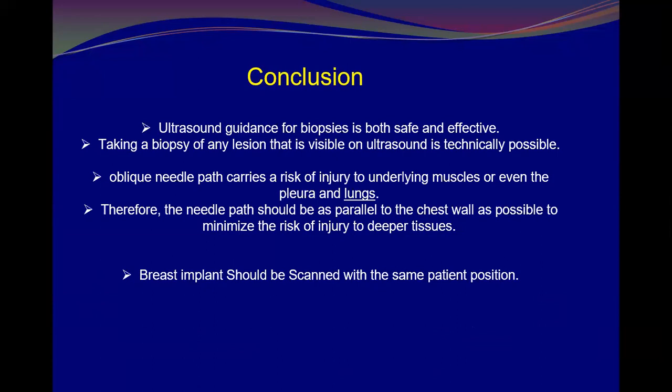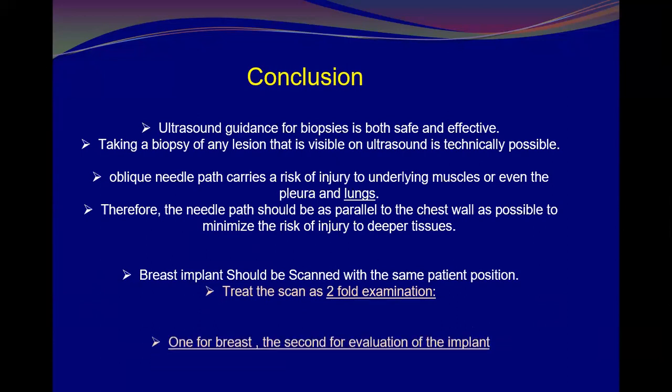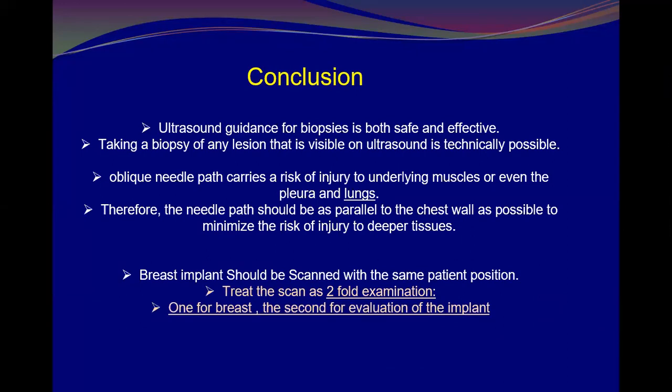Therefore, the needle path should be parallel to the chest wall to minimize injury to deeper structures. Breast implants should be scanned with the same patient position. However, consider a 2-fold examination, one for the implant and the other for the breast tissue.